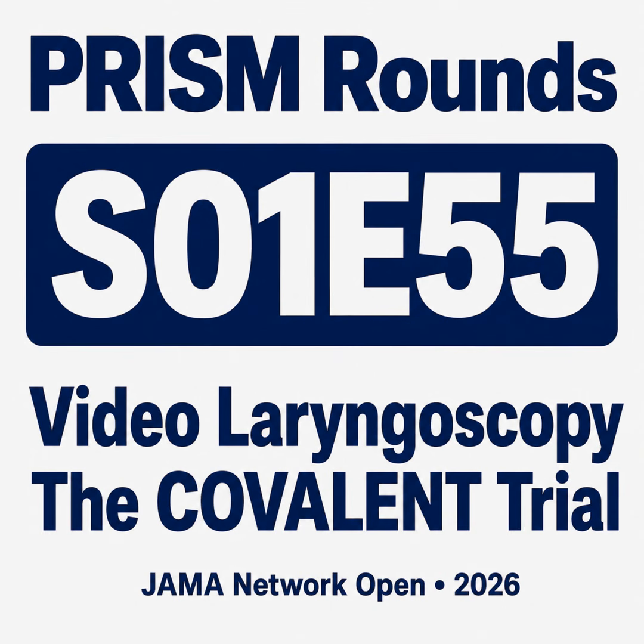COVALENT, despite being a controlled operating room trial, adds another heavy, undeniable brick to the wall of evidence favoring video. For the critical care clinician, the question is no longer, should I use video? No, we've moved past that. The evidence from massive trials like DeVice has already answered that for the ICU.